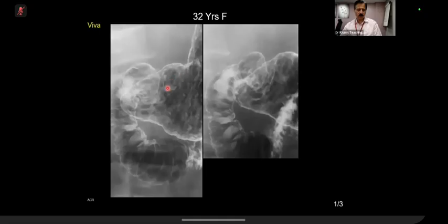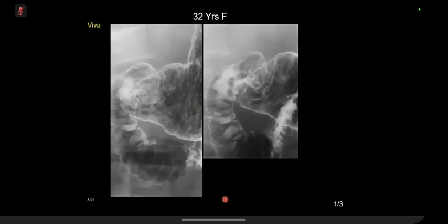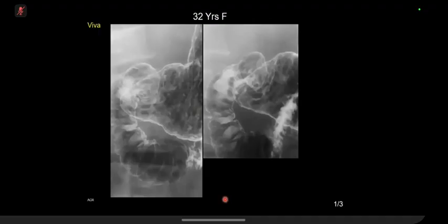I am interested in this region. Yeah, so within the generally irregular mucosa, there are small areas where there's punctate pooling of the contrast with a surrounding less dense area. They're multiple and they're small in size. They look like ulcers and they have the characteristics of aphthous ulcers.